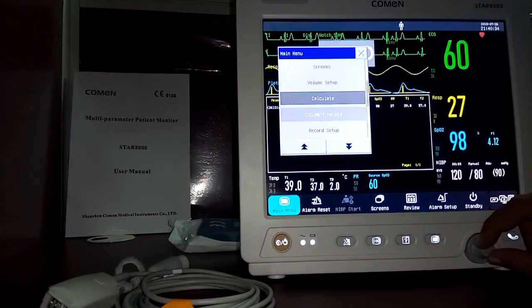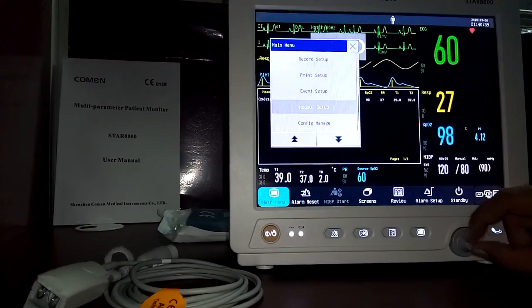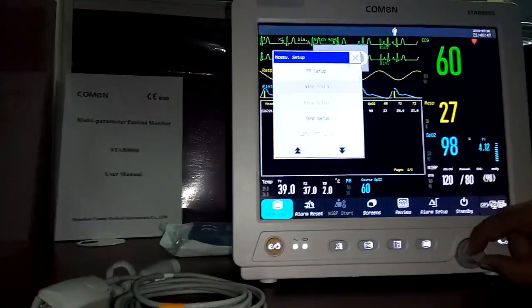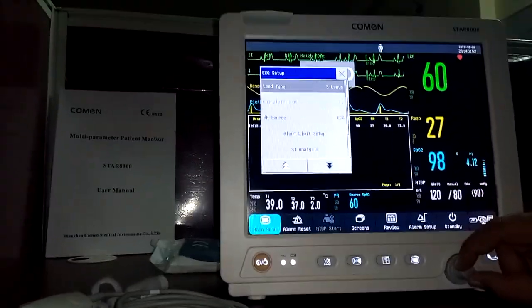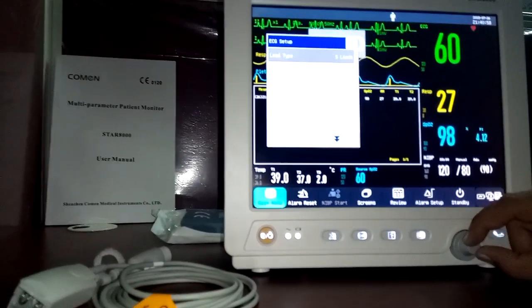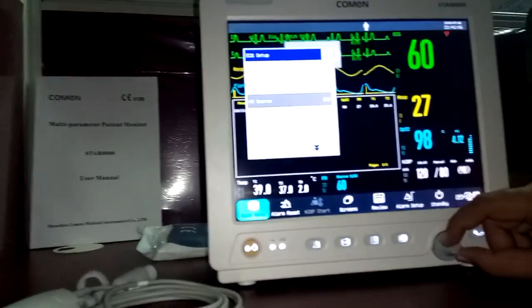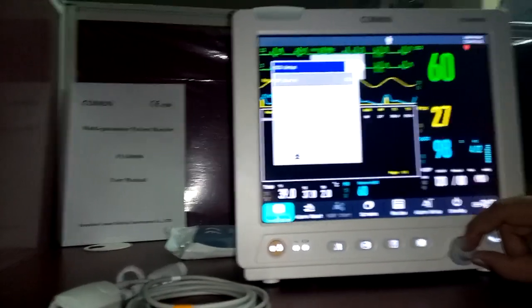Under document manage, you can manage document records and print settings. In measurement setup, you can configure ECG settings — including 5-lead or 3-lead cable selection, auto mode, and heart rate source (SpO2 or ECG). ECG alarms, ST analysis, and arrhythmia analysis can all be configured here.